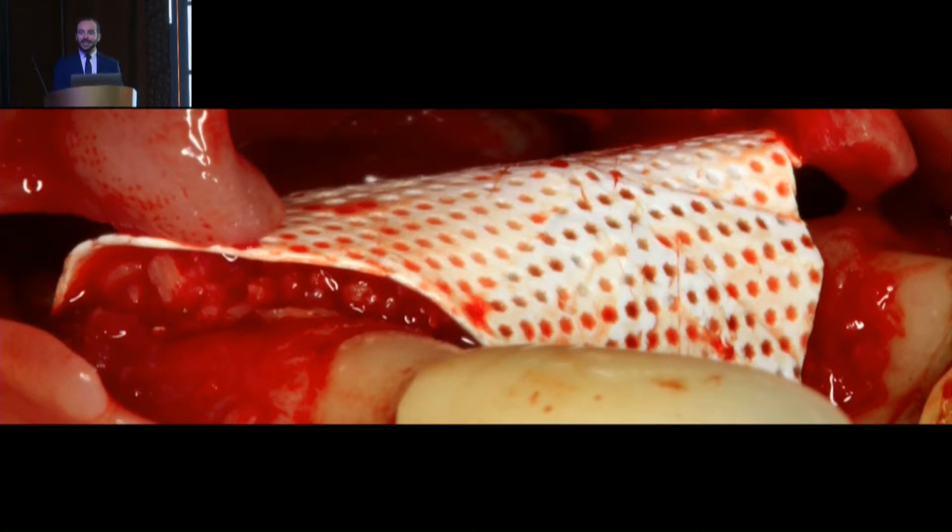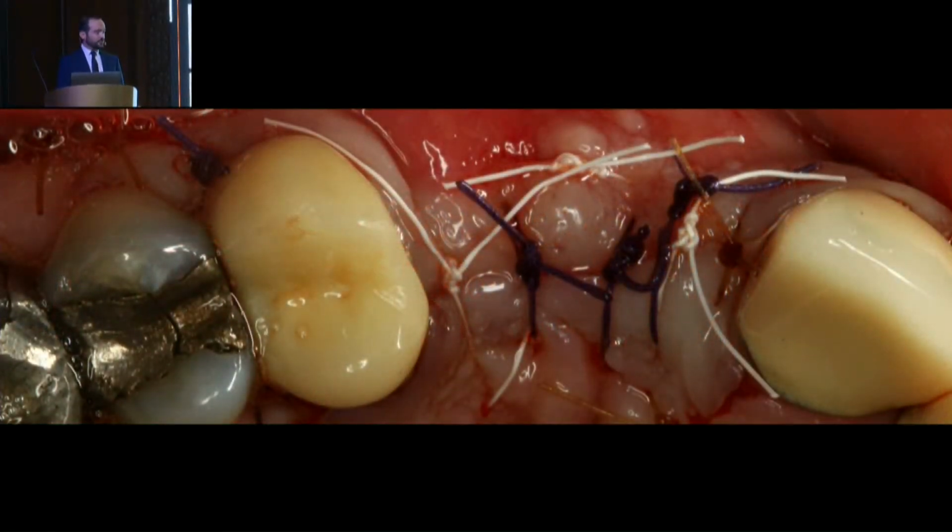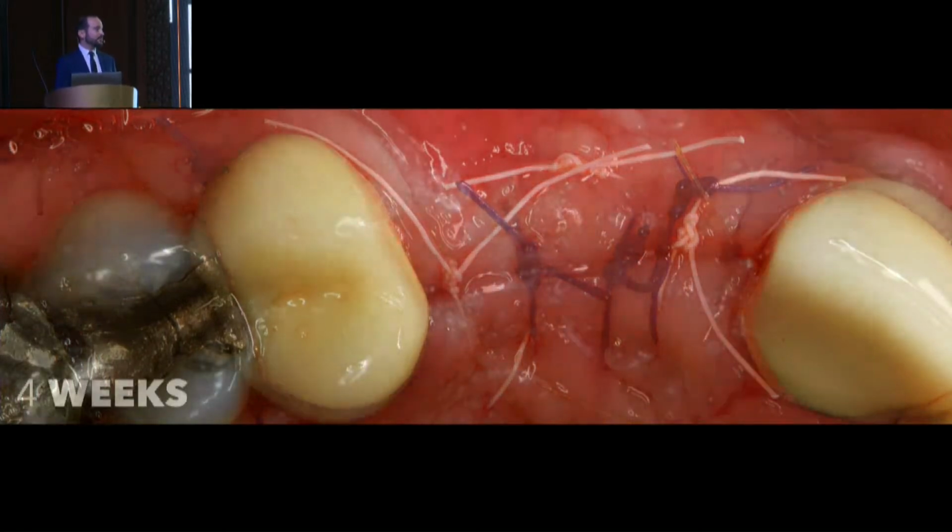We want to maintain and protect that biomaterial for the next few weeks and months, preventing the collapse of the soft tissues and providing sufficient time for the bone to form and mature. We close the soft tissues. We obtain, of course, primary closure. And we follow up this patient for the next few weeks.